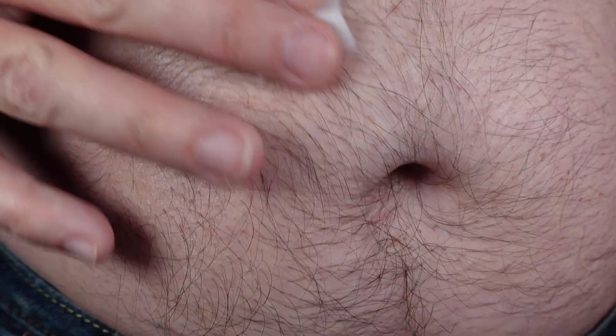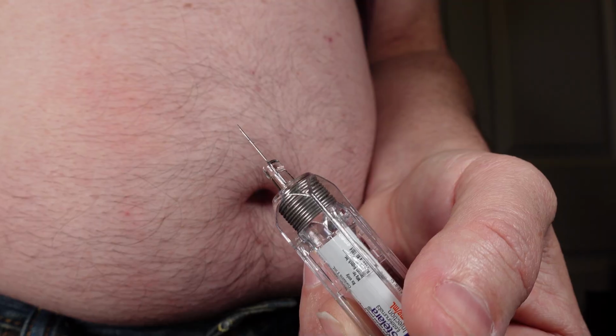I always use my stomach as the injection site. It seems to work out easier. Some people like to use their thigh. I've never done that. I heard it might be a little more painful. So whichever injection site that you choose to use, make sure that you clean it very thoroughly using your alcohol pad. Once that's done, now we're ready to move on to the 4th step, which is the actual injection.